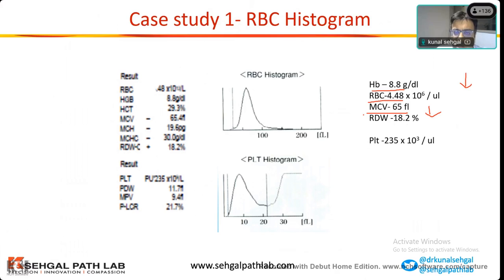Very nice. So based on the low MCV, first you said there is anemia. I didn't tell you the age or the sex of this patient, but for any age or sex, 8.8, assume this is an adult female. Where would normal hemoglobin be for an adult female? So 12 to 14. Excellent. Above 12. So anything less than 12 in a non-pregnant adult female, this is anemia.